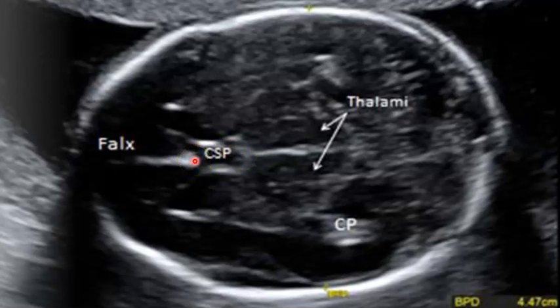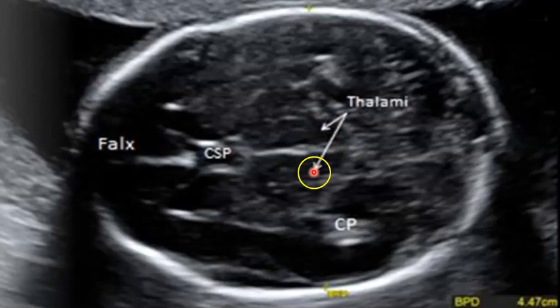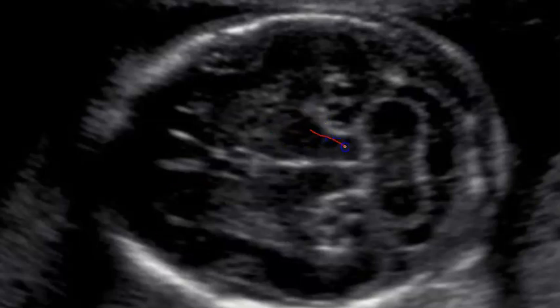The third landmark we want to use is the thalamus, which is going to be this kind of hypoechoic structure. Fun fact: if you're having a difficult time determining where the front of the baby's head is versus the back, look at the thalamus — it kind of makes an arrow shape and that arrow is always going to point towards the back of the baby's head.